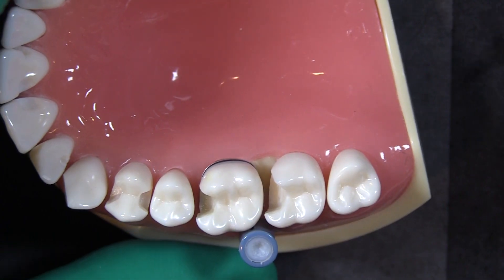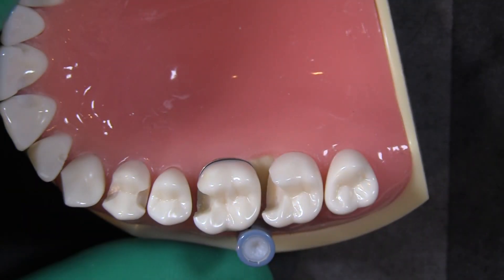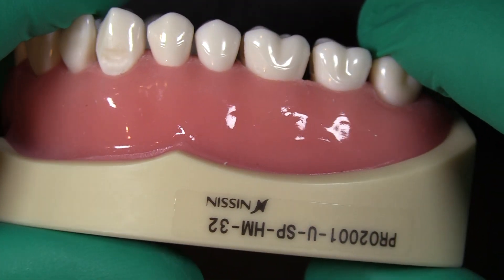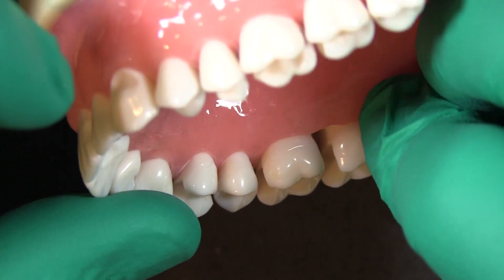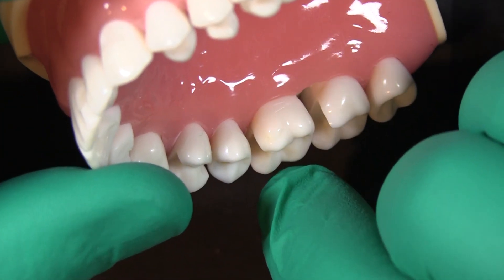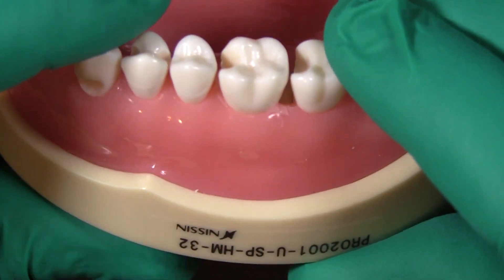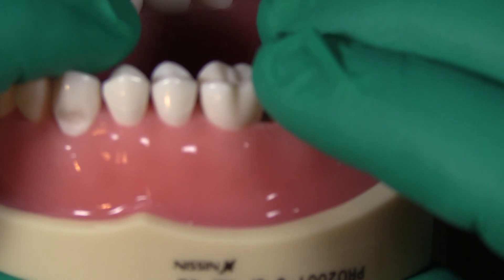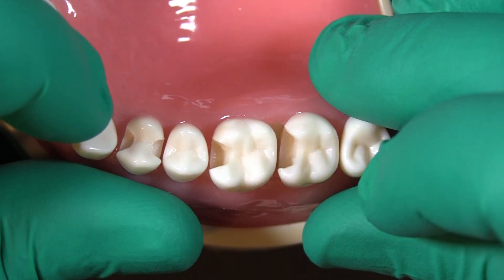It looks pretty good — we'll cure that, maybe do one or two more layers. When we take this off, you can see a much more manageable preparation where we can now get a wedge in there, and there's no finishing or anything necessary at this point. When we do this initial deep margin elevation increment, we don't want a lot of refining of the preparation at this stage. We want to let the matrix band do the work for us, and because it's so tight around there it does a really good job.